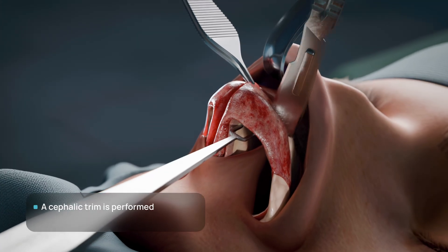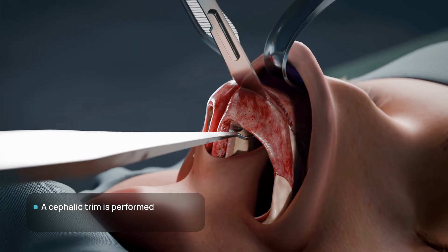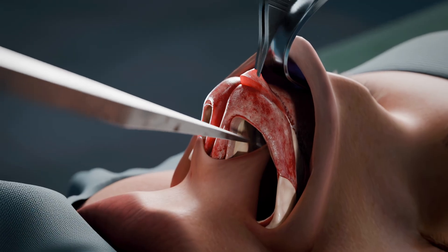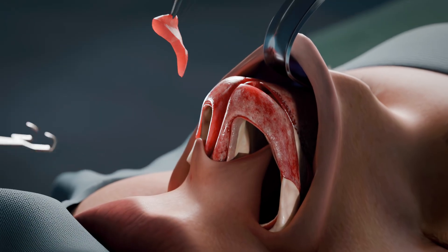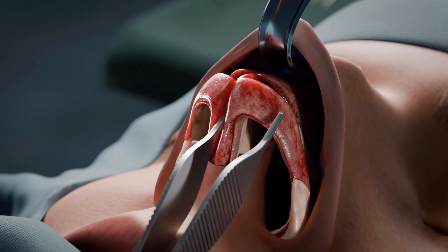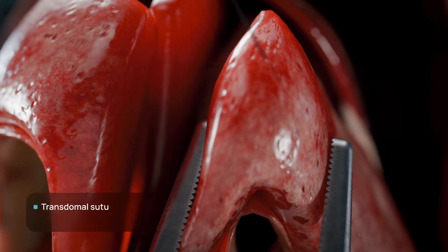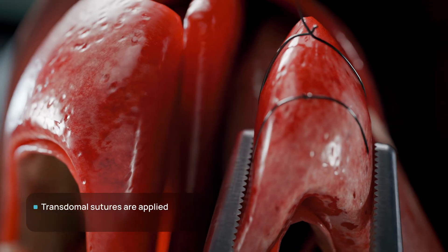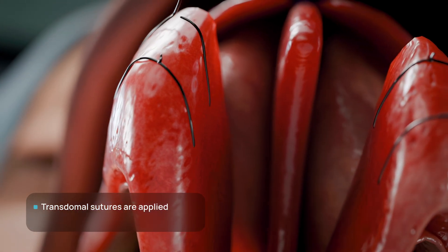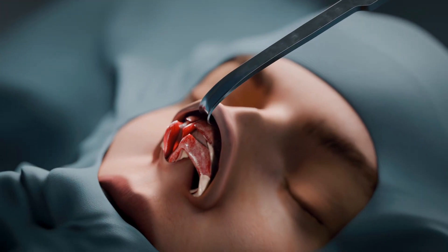A cephalic trim of the alar cartilages is executed. The superior portions of the alar cartilages are partially excised, and the remaining segments are reshaped and sutured to restore symmetry.